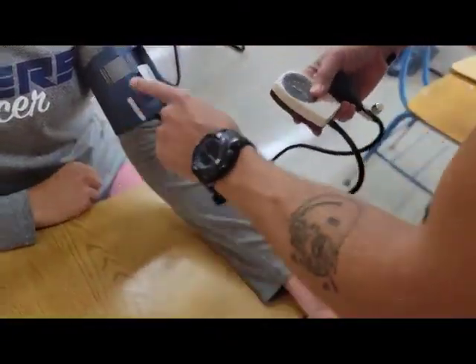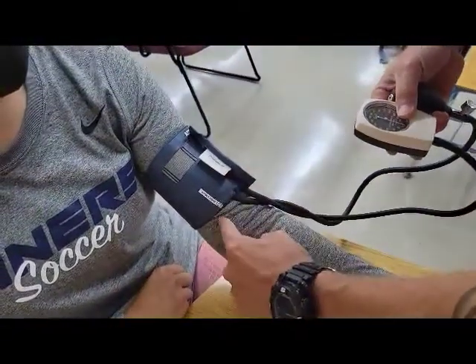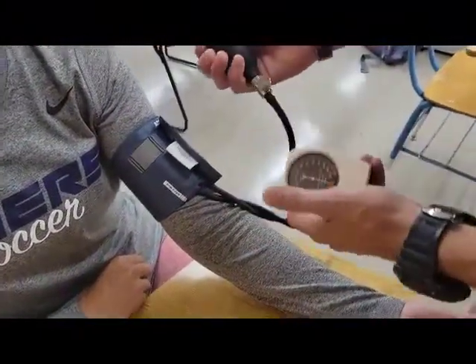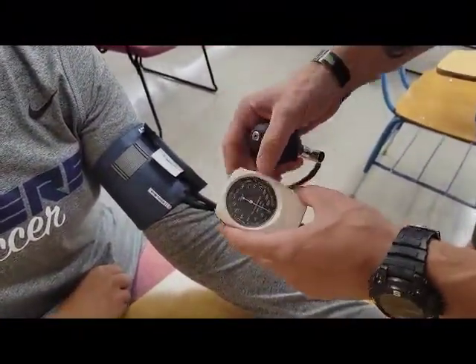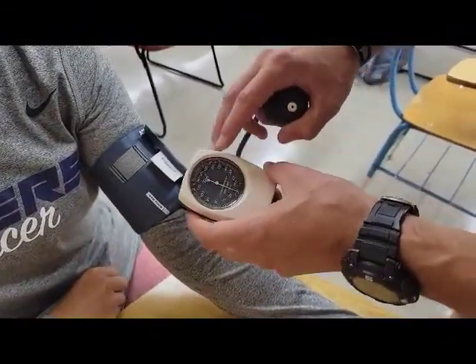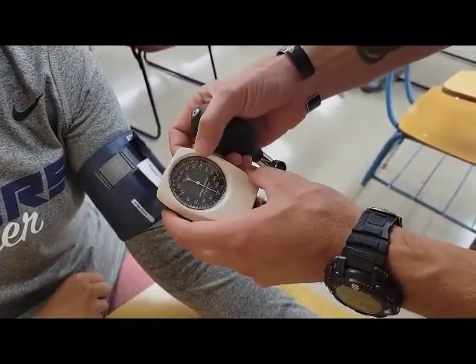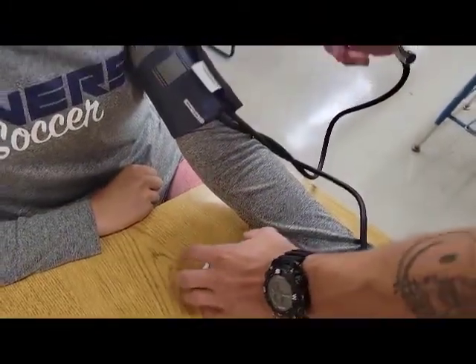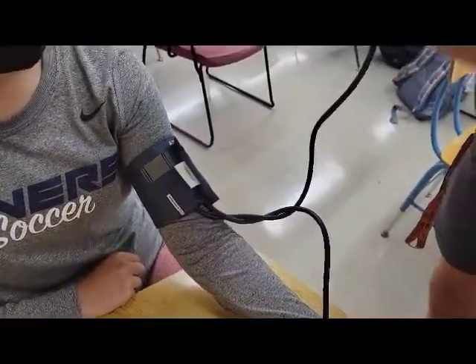So, again, we're going to have the label right on the brachial artery on the bicep. And make sure the valve is closed all the way so the air will fill up. And what we're going to do is pump it up to about 200 millimeters of mercury. That should give us a good starting point to record the systolic pressure.